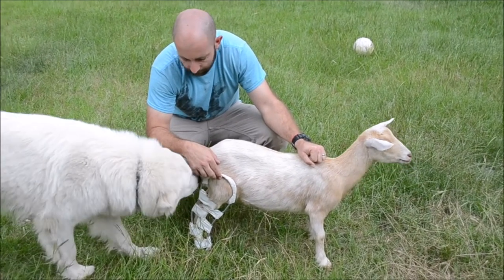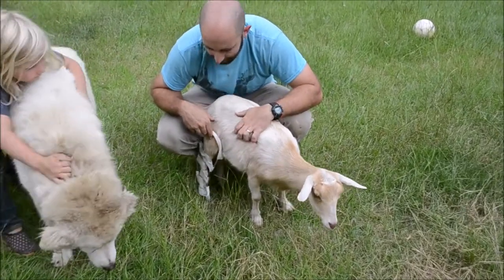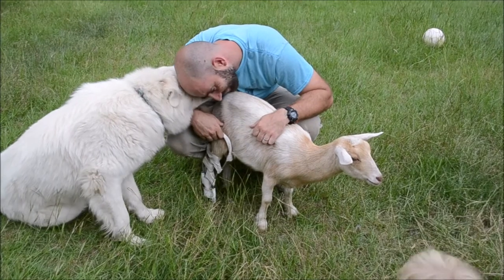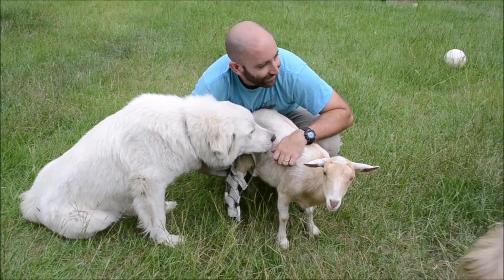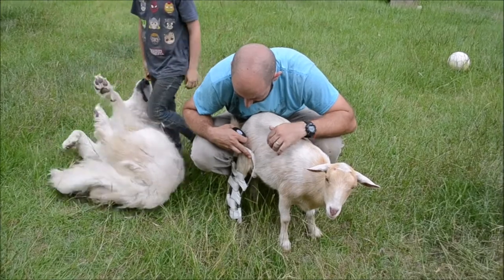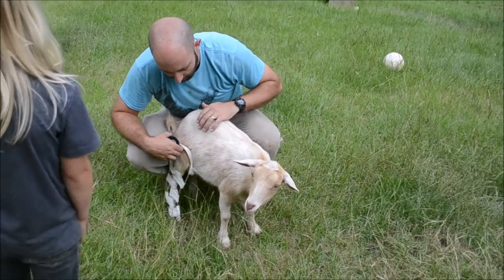This is what we have going on so far. Everybody's pretty interested in it. Be careful around her. Got the brace on. I still need to put whatever this bandage is on just to kind of secure it a little bit more, because I'm not sure where exactly the injury is. I'm going to wrap this to her leg a little bit better and wrap it around her body as well.